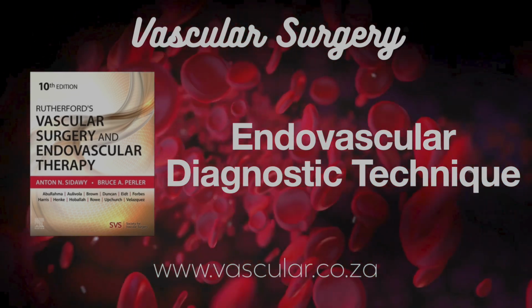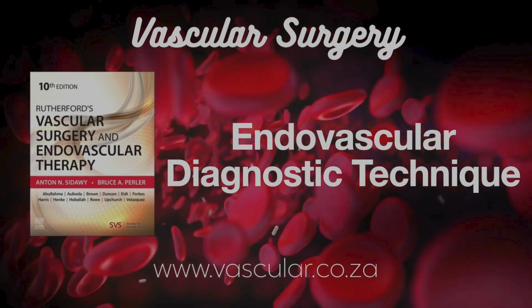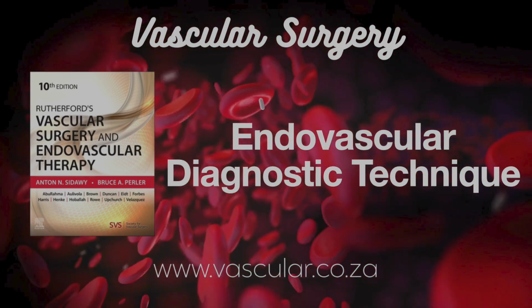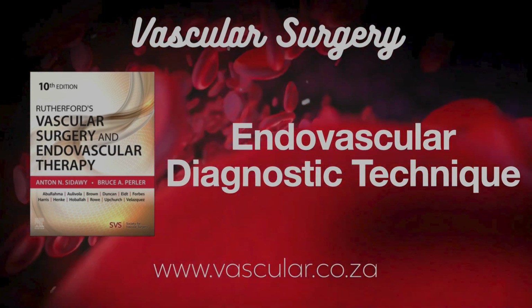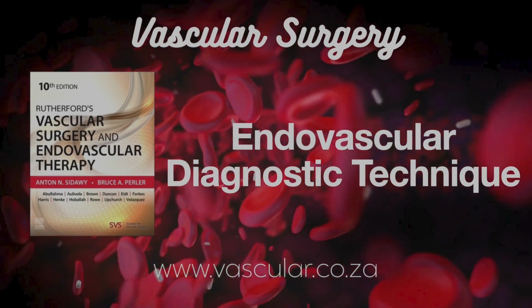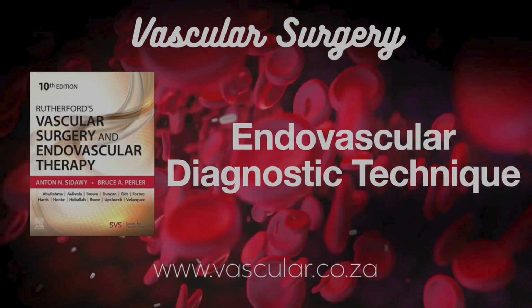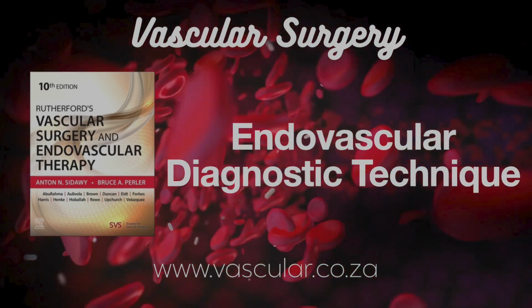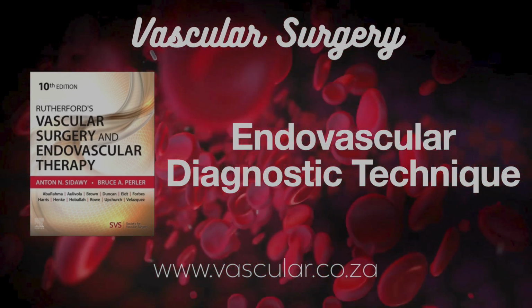And finally, systemic complications, affecting the whole body. Three main areas: the iodinated contrast dye, the anticoagulation drugs used, and radiation exposure. Contrast issues: kidneys. Contrast-induced nephropathy, CIN. Risk is higher for patients with poor kidney function, minimized by using less contrast and ensuring good hydration. CO2 gas can be an alternative for big vessels in kidney disease, but not great for small leg vessels. For allergies, they can happen. Pre-treat with antihistamines and steroids if there is a known allergy.